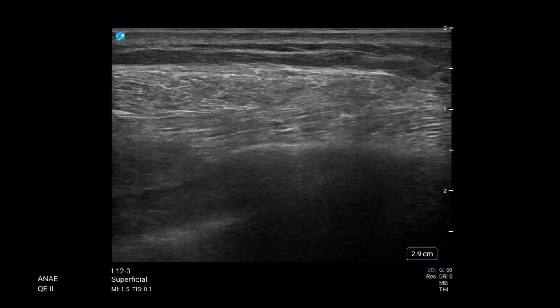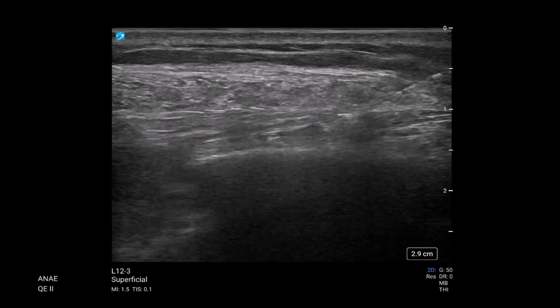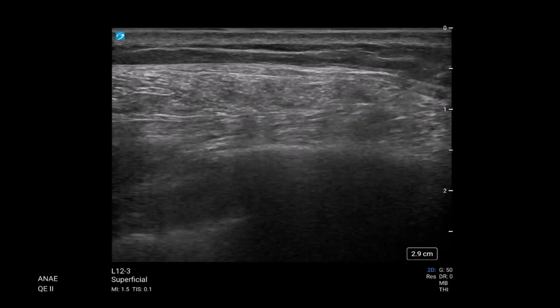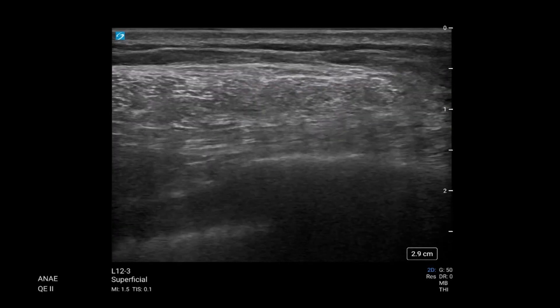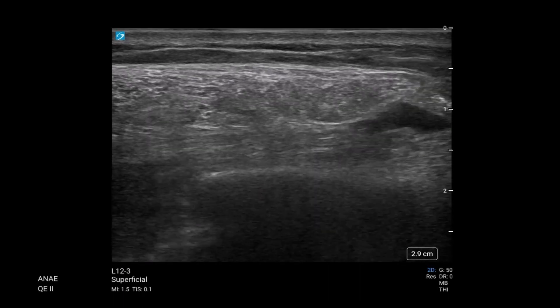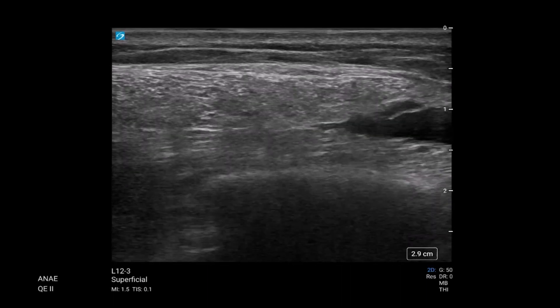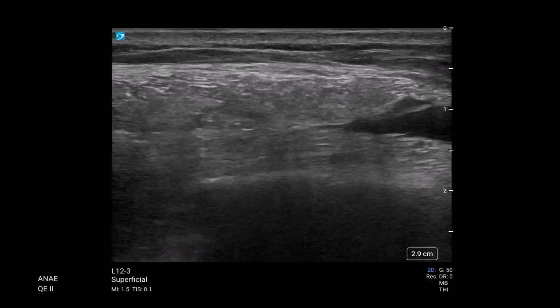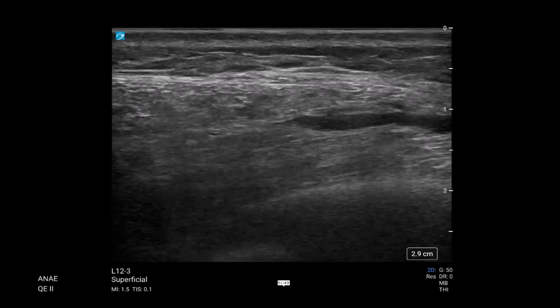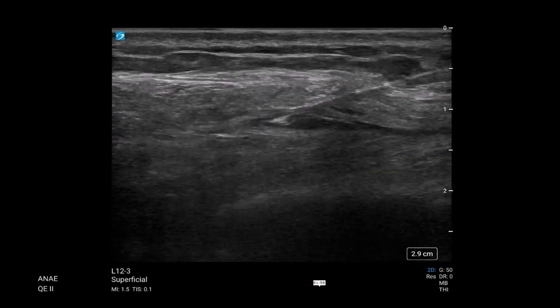We've gone intramuscular intentionally with a 25-gauge needle, putting very gentle pressure, then withdrawing ever so slowly, looking for that change from an intramuscular to an interfascial injection. Which is what we've now achieved — we've created essentially a landing zone. Where we couldn't really work out where the fascia was before, now we've created one. Back on now with our catheter set in hand, and that space is still there. It certainly made our job a little easier.